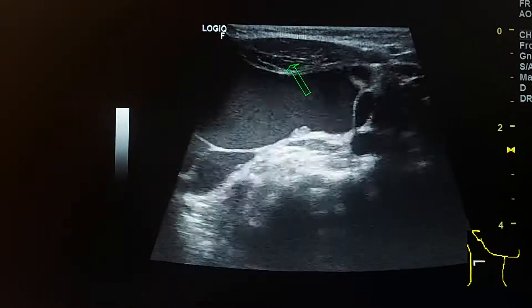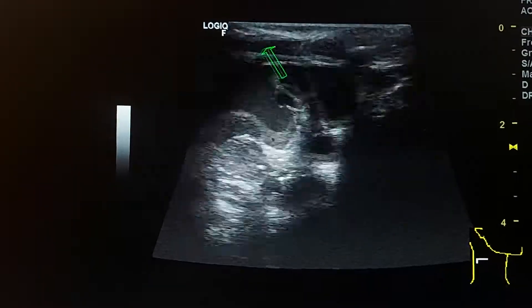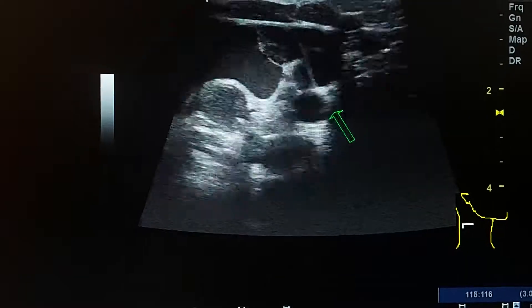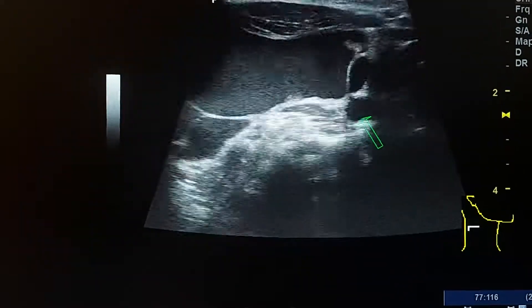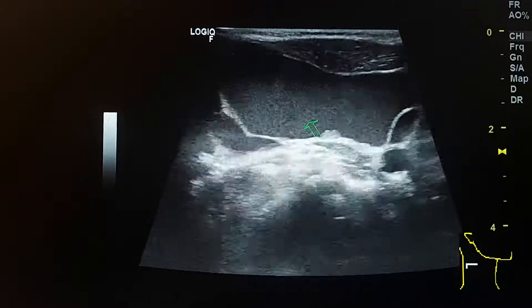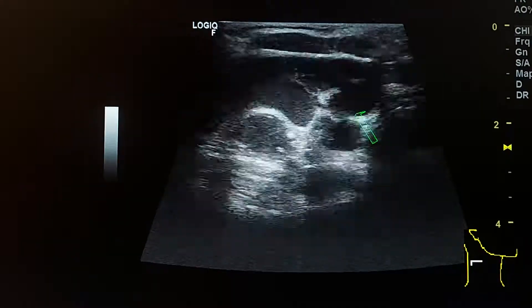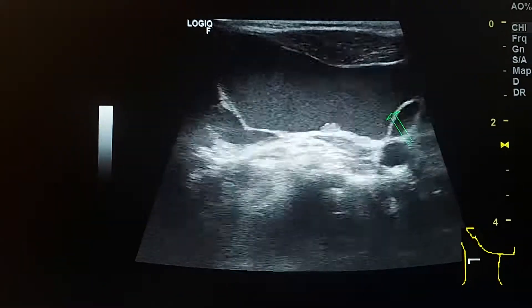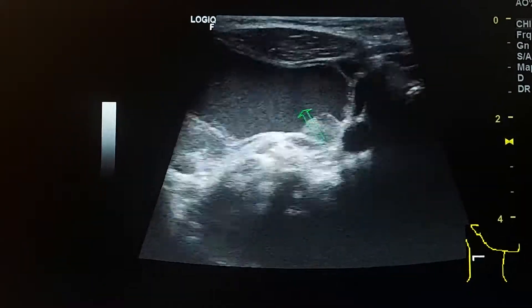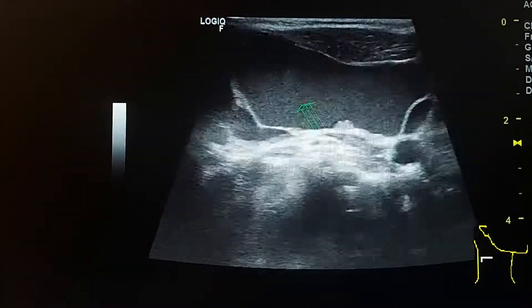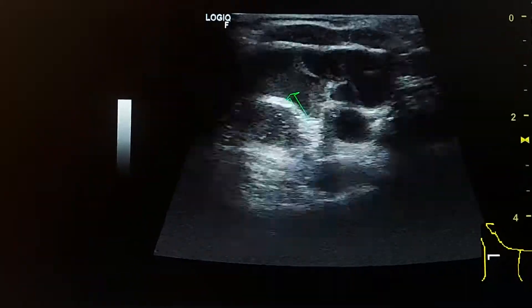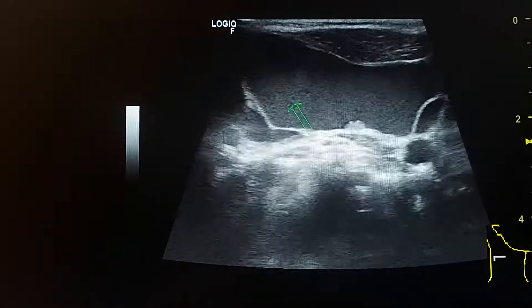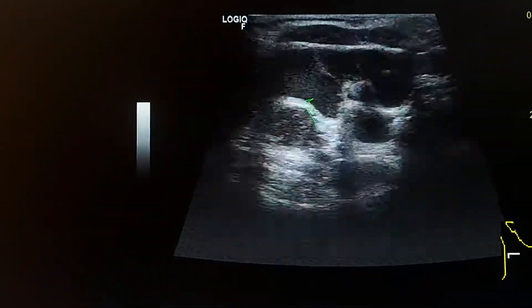Here is the sternocleidomastoid muscle. This is the common carotid artery. We see a small locule here, which is anechoic, while this large cystic lesion here is a little bit hyperechoic.